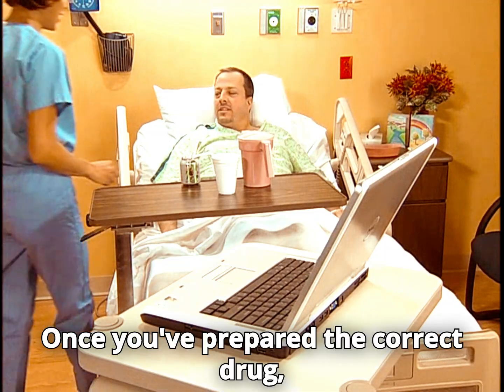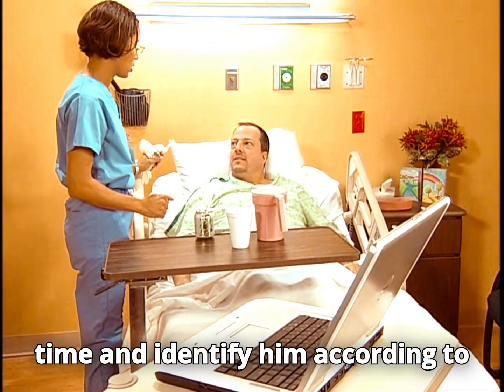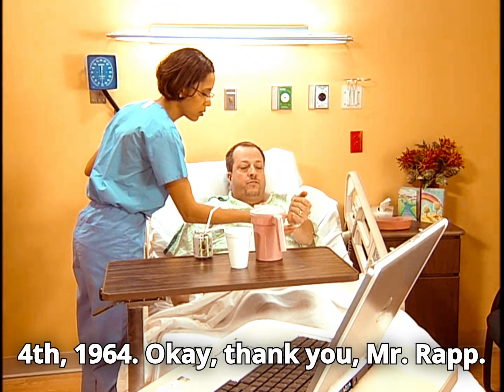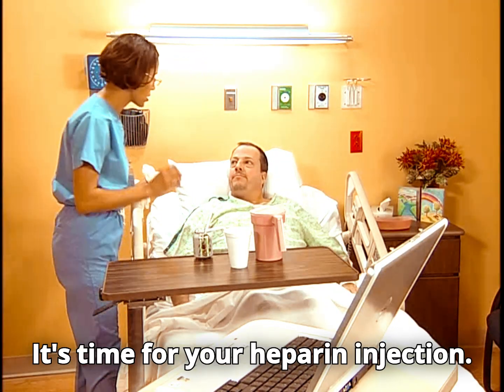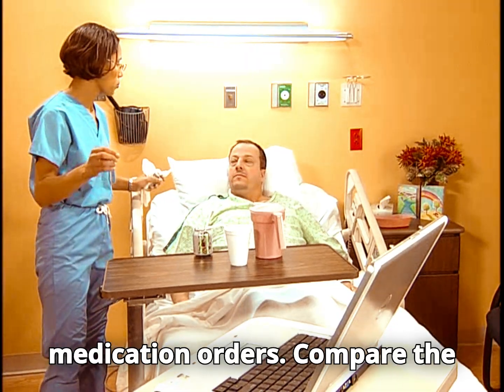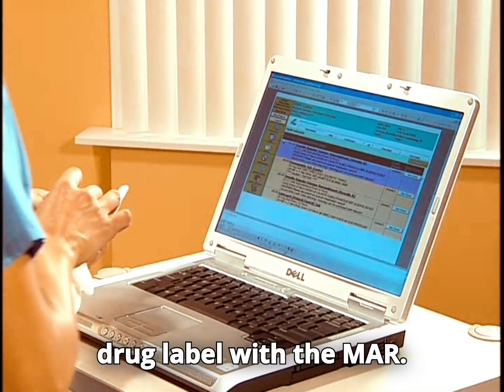Once you've prepared the correct drug, take it to the patient at the correct time and identify him according to facility policy. This is Frederick Rapp, March 4, 1964. It's time for your heparin injection. I'm just going to check your medication orders. Compare the drug label with the MAR.